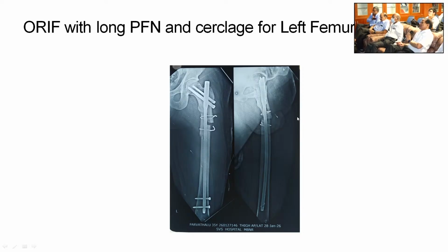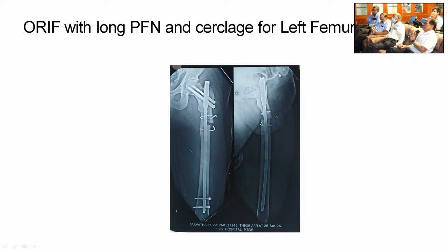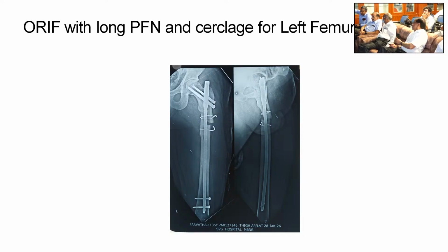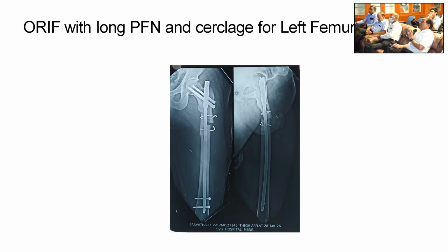You're not neutralizing. The whole idea is neutralization of the deforming forces. You must neutralize, then only the implant will work. Otherwise, it will fail. Entry point, yeah, but you must correct it.